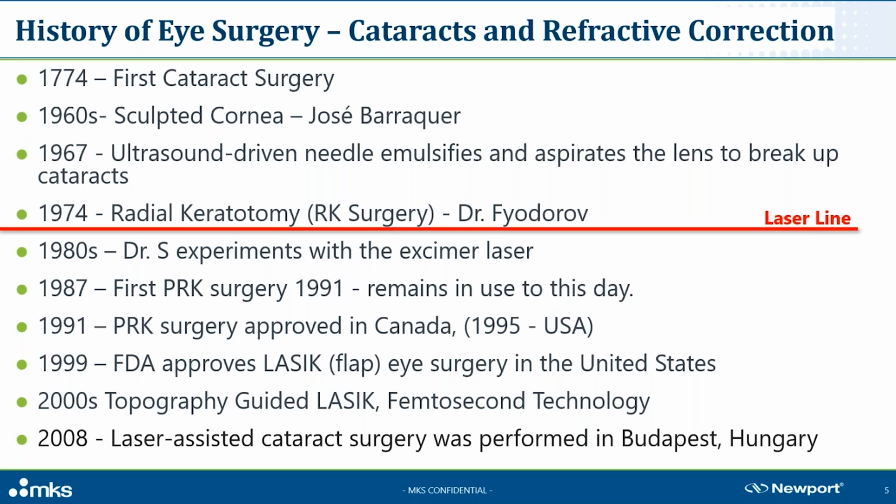20 years after that, a major breakthrough came when an Indian doctor, Dr. S, at IBM discovered that an excimer laser was able to remove living tissue without causing thermal damage to surrounding cells. After 3 years of collaboration with IBM, another doctor, Dr. Stephen Trokel, applied this discovery, at risk to his career, and was the first to successfully reshape a human eye using a laser. Through continued testing, they found that laser surgery could be effective in treating nearsightedness, farsightedness, and astigmatism. Much later, Obama awarded Dr. S the National Medal of Technology and Innovation for his work on excimer lasers.